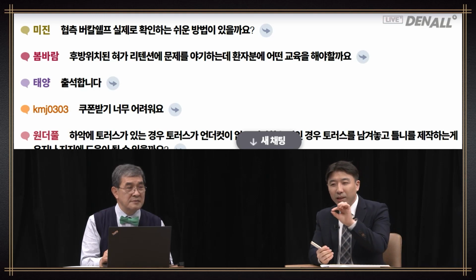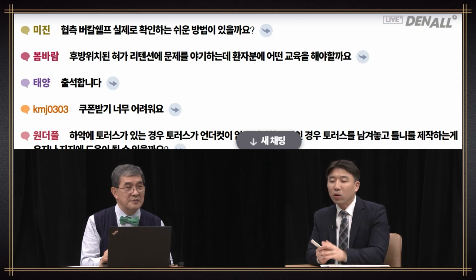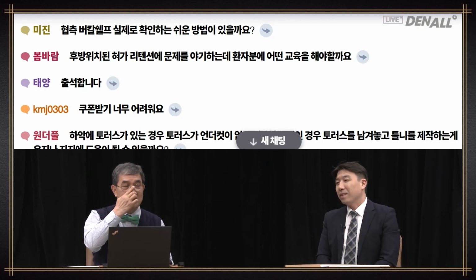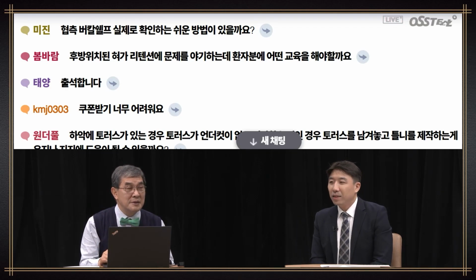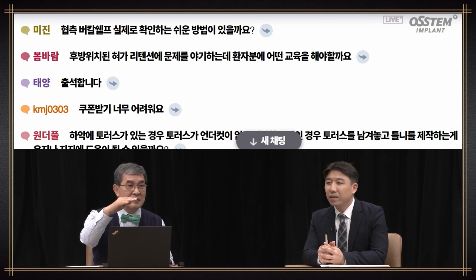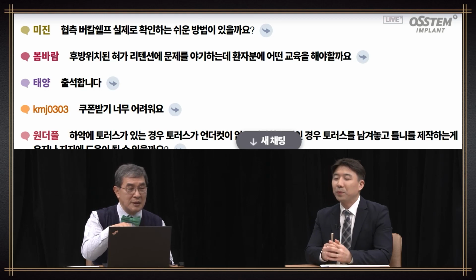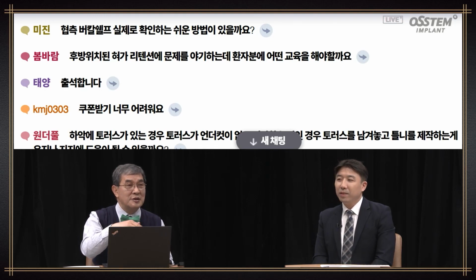It's reflected in the textbooks, but if the training is difficult, we can make a training groove intentionally so the patient can touch that. You can make an artificial structure. When we deliver our prosthesis, we need to tell the patient to stick the tongue towards the incisal edge of the lower. It's not easy for the patient. We need to make a groove or a shelf in the midline area to make the patient protrude the tongue more easily.